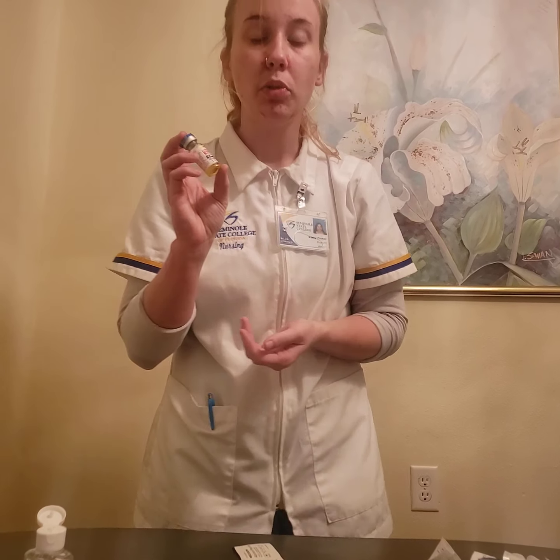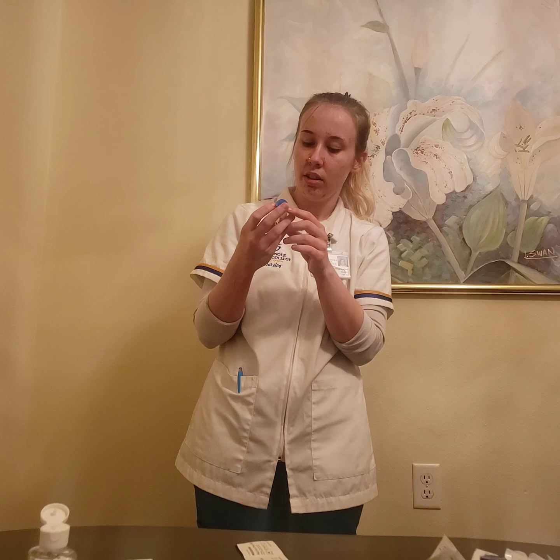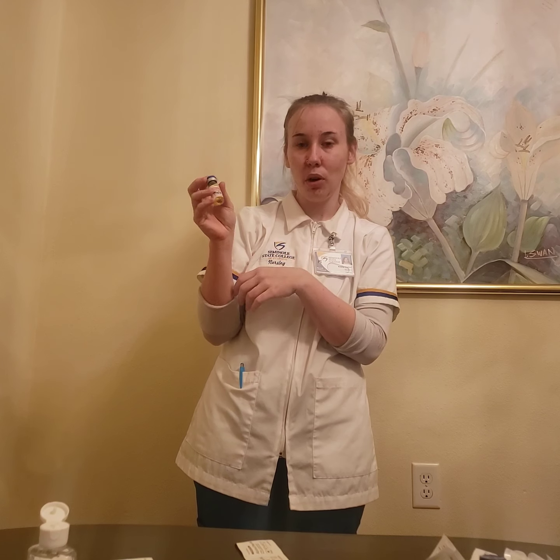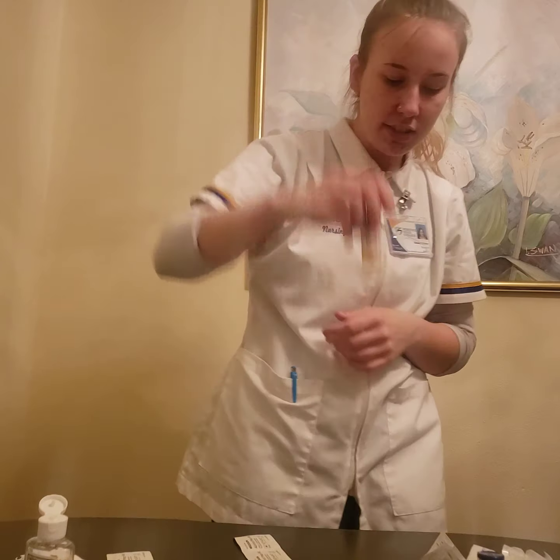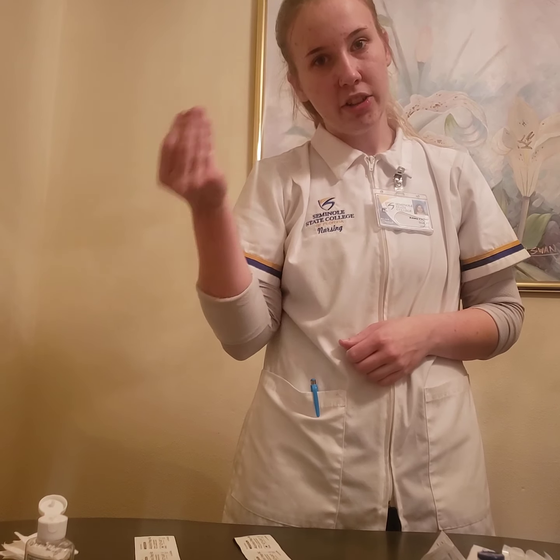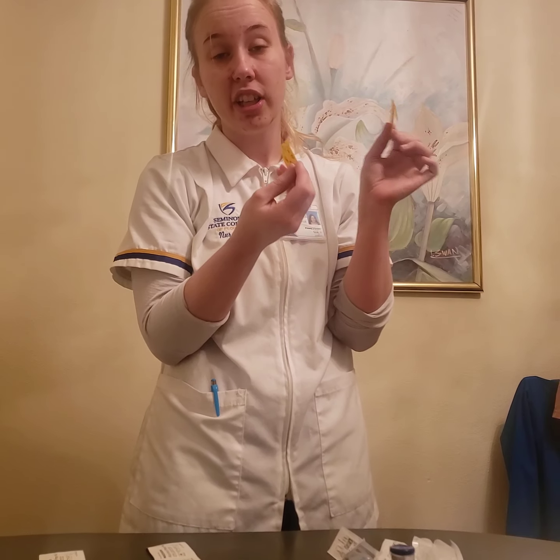And then I have my B12 injection here, my cyanocobalamin. It's also a multi-dose vial, so I have it being 500 micrograms. It's 1,000 micrograms per milliliter. It's got the time date and the initials of who opened it. And I can see that there's nothing floating in it. There are no particulates. Okay. I'm also going to need some alcohol prep pads, some gauze, and I'm going to have gloves that I do not have, but I'm going to verbalize that I'm using. And then I have labels to label my syringes after preparing the medication in the med room.